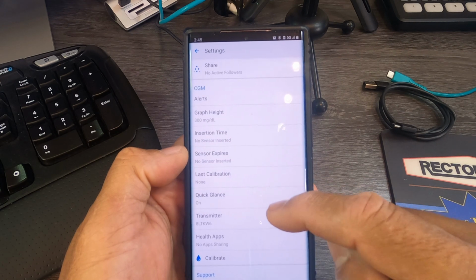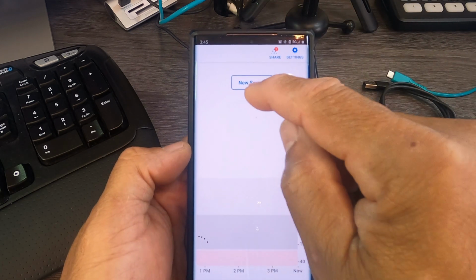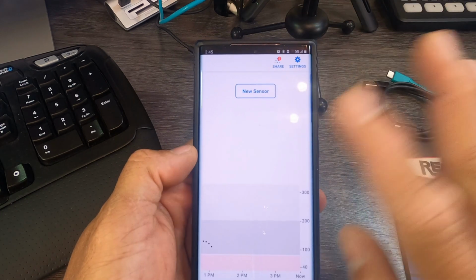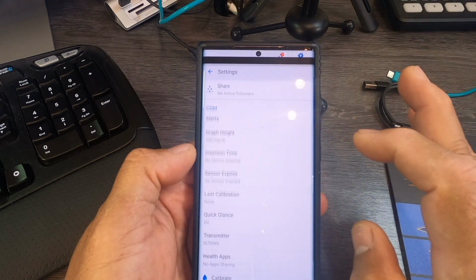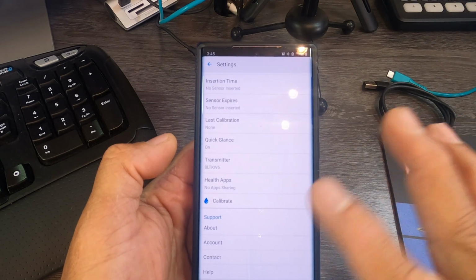And one of the mistakes that people make is when they stop the sensor here, they go back and start a new sensor right away. You don't want to do that. That's a big mistake. That's a big no-no. So you want to go back up there, and after you stop the sensor, make sure it's not running, it's clear and everything like that.